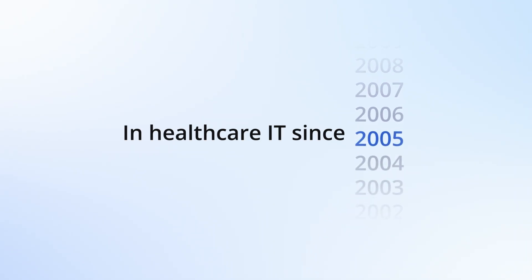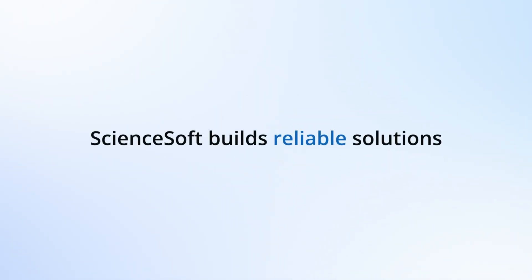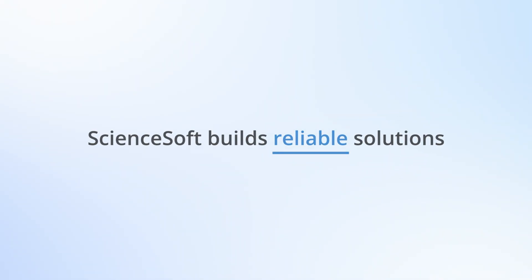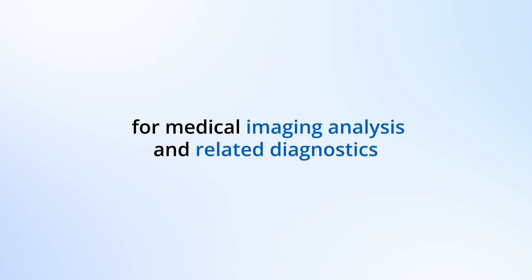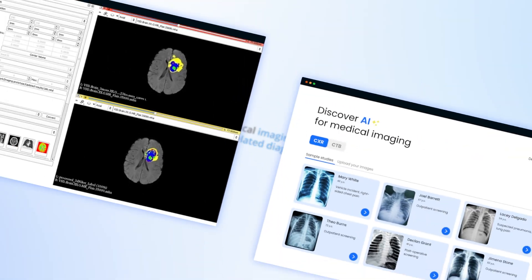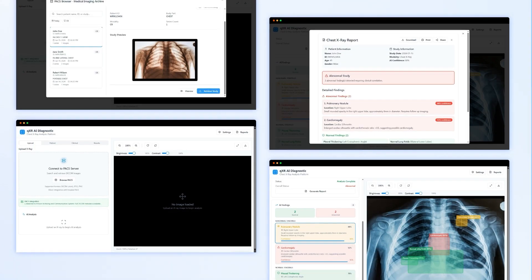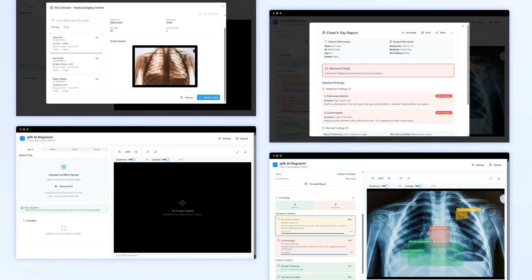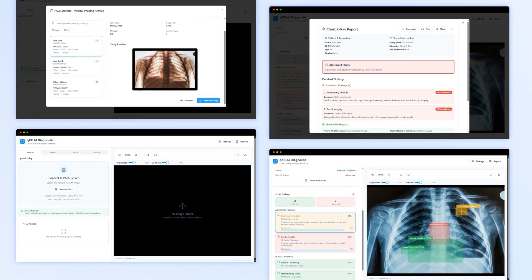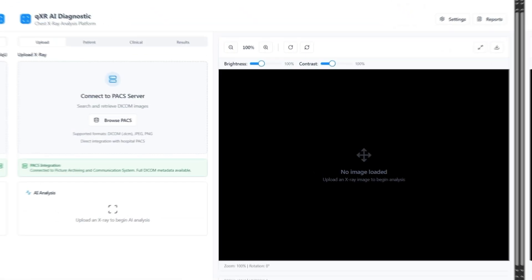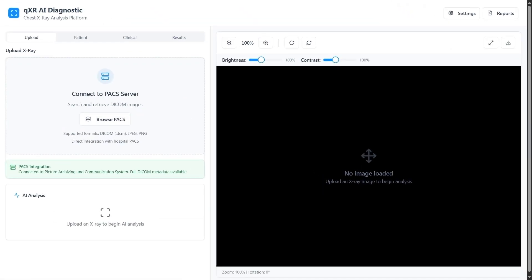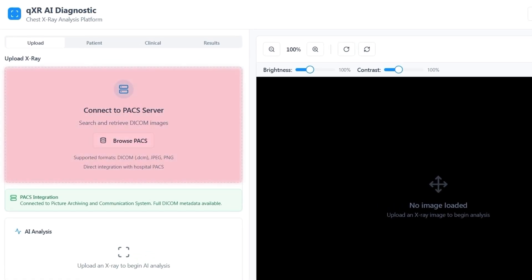In healthcare IT since 2005, ScienceSoft builds reliable solutions for medical image analysis and related diagnostics. Here is a demo walkthrough of an AI solution for advanced x-ray diagnostics. Let's see how it works.